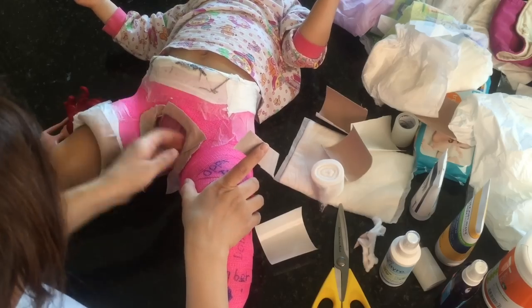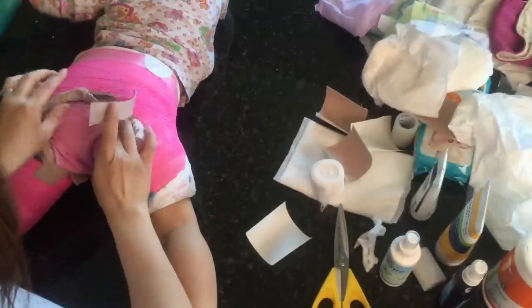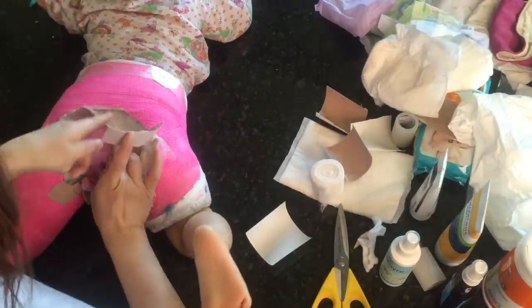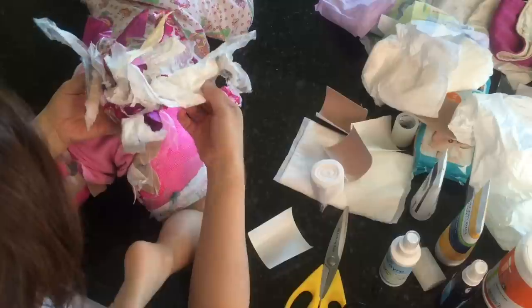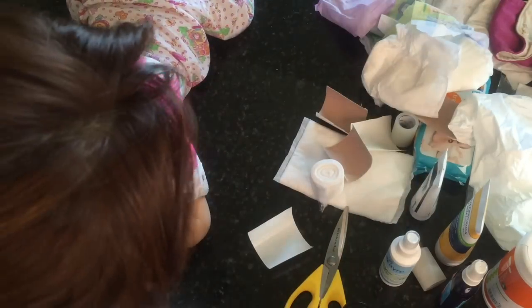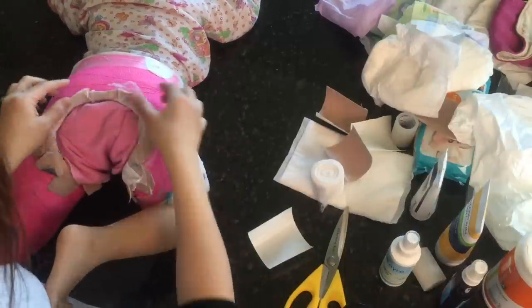I turned her over to the back — there's another hole there so I did the same thing: cut it all open. She has one week left in the cast but I'm doing this because some areas needed more cleaning. Right before, you can see all the dirty stuff she had — yellow and gooky. You probably want to do this every other week depending on how long your baby is in the cast.